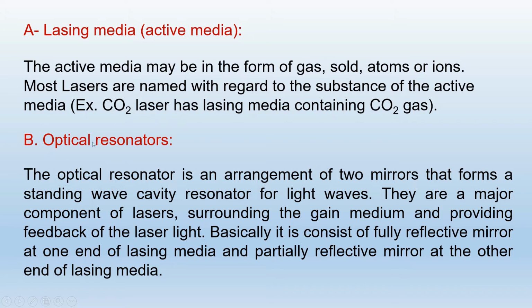The optical resonator is the arrangement of 2 mirrors that forms a standing wave cavity resonator for the light waves. They surround the lasing media and provide feedback of the laser light, and basically it consists of a fully reflective mirror at one end and a partially reflective one at the other end of the lasing media.